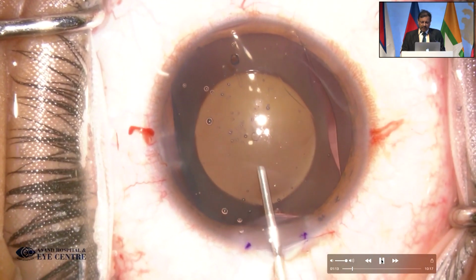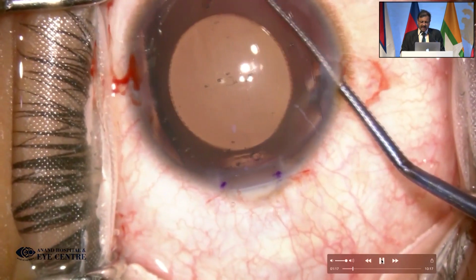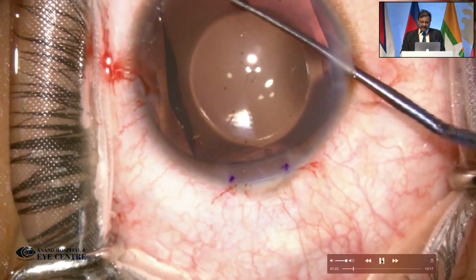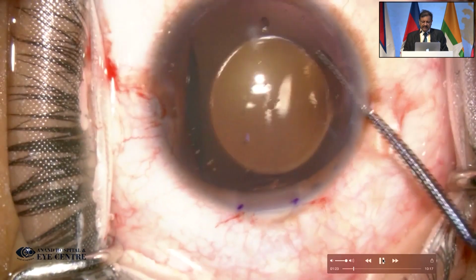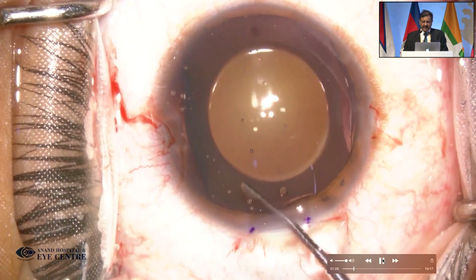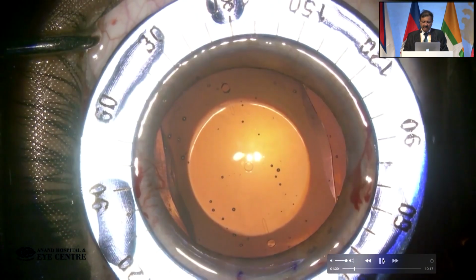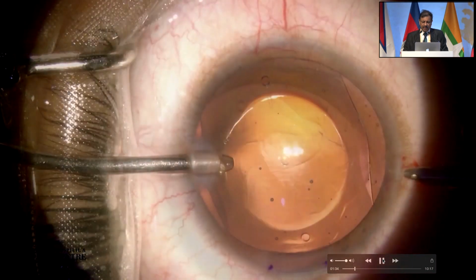Push in, go on top of the lens, push in some amount of viscoelastic so that you have a space between the endothelium and the lens, and gradually tuck. So tucking has to be at the junction of the plate and the optic. Never touch the optics here because this is the thinnest and most delicate part of the phakic lens. So tucking, the trailing could be through the main wound or the side.